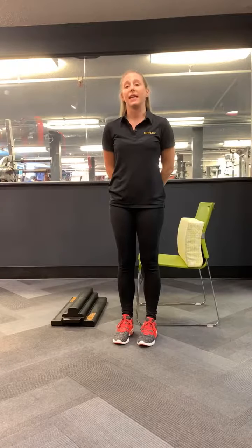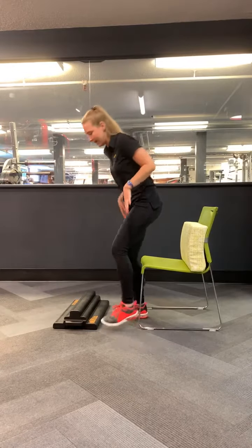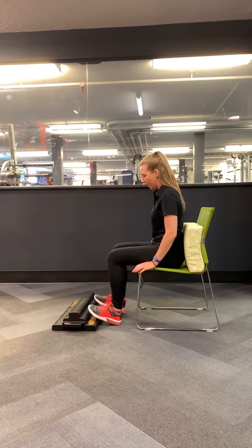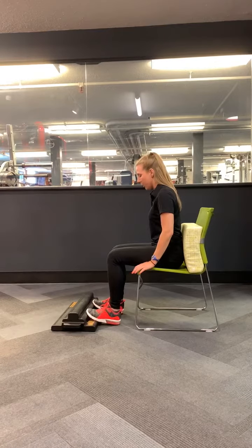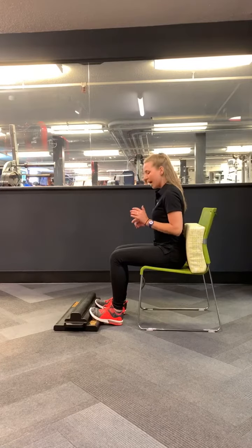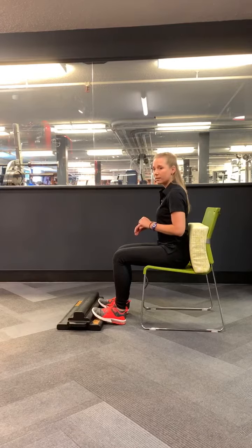Please use this video daily to practice your Stand Tall program at home. So we're going to start seated in our chair in front of the Moflex, and you're going to place your heels on the floor in front of the Moflex with the balls of your feet on the first tier, with your toes just reaching for that second tier or touching your second tier. Go ahead and just wiggle those toes around, get a feel for the position of your feet, making sure that we have contact at all 4 gait points.